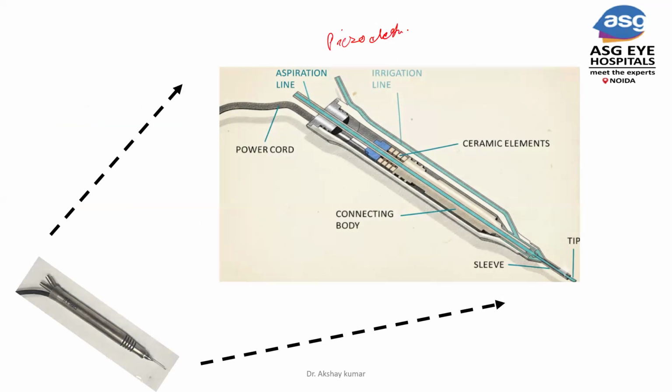Okay, it works on piezoelectricity. So whenever electricity is passed through the electric cord, it is directly transmitted to the piezoelectric ceramic crystals. Here I'm drawing a diagram. Here we have the ceramic elements, and whenever the electricity passes here, it vibrates. Its vibration is directly transmitted to the phaco tip with the help of the connecting body. So this is how it works.